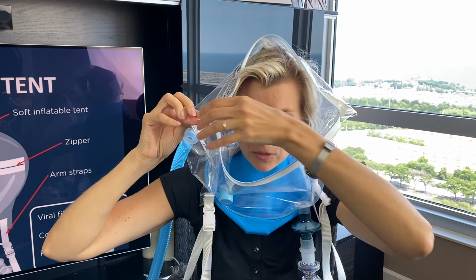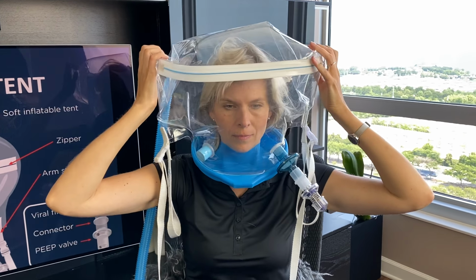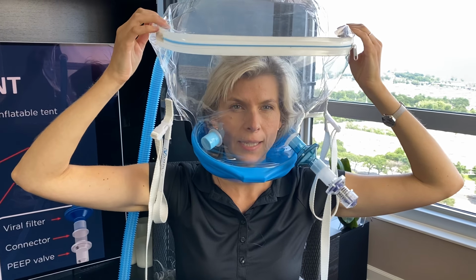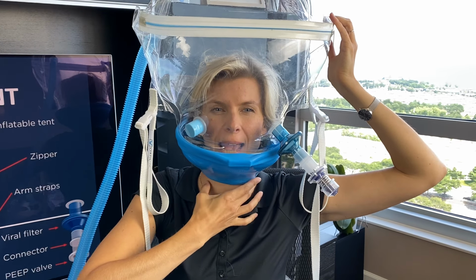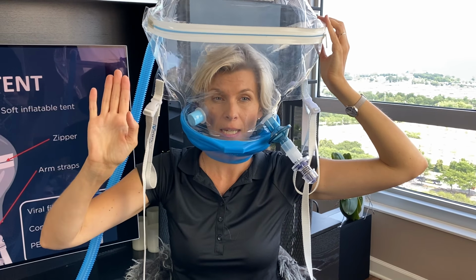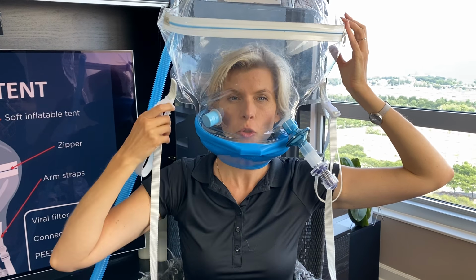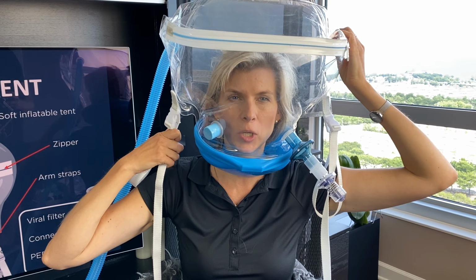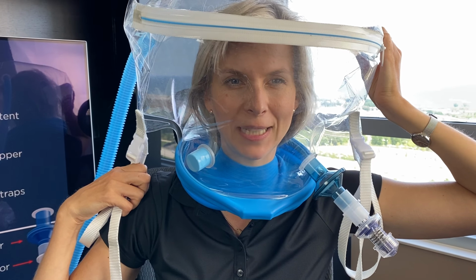Okay, and now we're going to close the zipper. As you can see, it inflates very quickly, and the tent is going up. And when it goes up, I have a neck seal issue here. And it's normal. It's happening with every hood, every helmet. This is why we need to have arm straps, to push the tent down. And that's going to help with the neck seal. As you can see now, when I push it down, there is no leak around the neck seal.